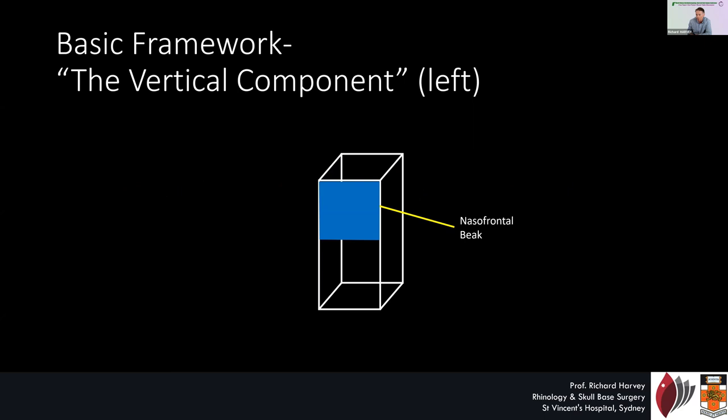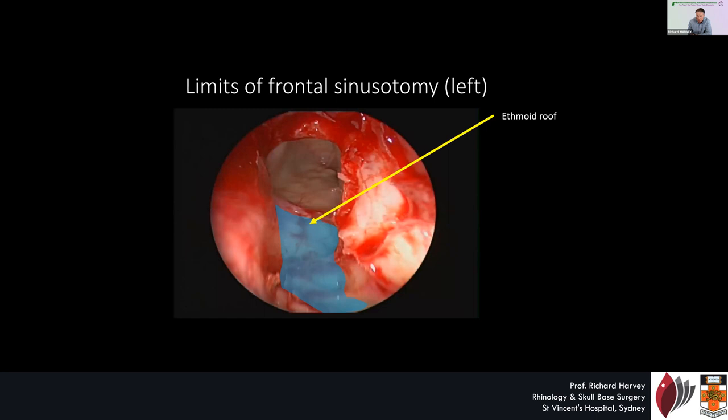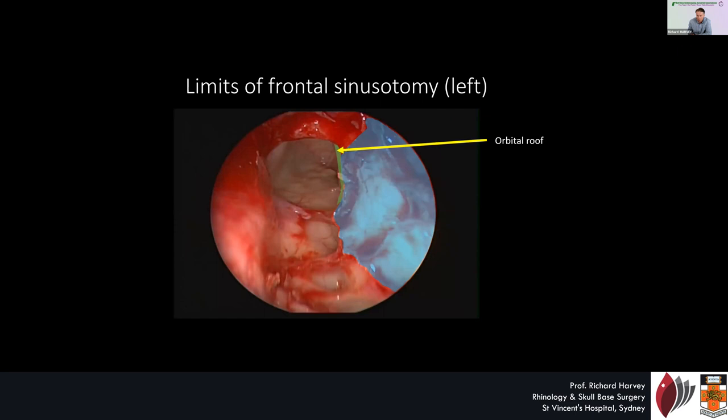If you look endoscopically, this is a frontal sinusotomy in which you can see the boundaries here. The nasofrontal beak is the anterior boundary, the posterior boundary is the ethmoid roof becoming the posterior table, the orbital wall becomes the orbital roof laterally, and then the middle turbinate becomes the intersinus septum medially.